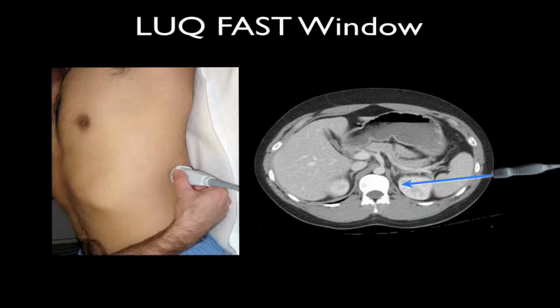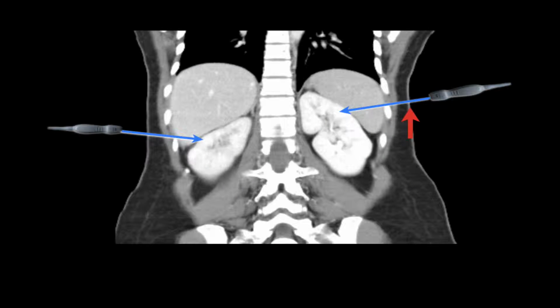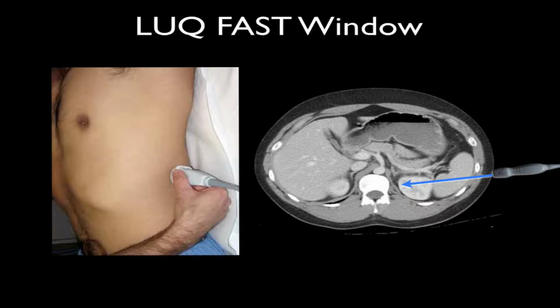Remember that the spleen is typically smaller than the liver. Therefore, when you're shooting the left upper quadrant in the FAST exam, the typical rib interspace is going to be one higher, or more cephalad, than on the right upper quadrant view. And we're looking for dependent fluid. Therefore, your knuckles really need to be right on the bed, posterior in the patient, and the angle of your ultrasound beam needs to be pointed posterior as well.